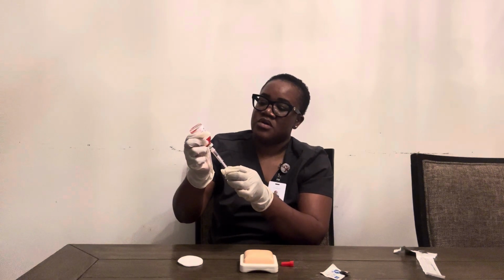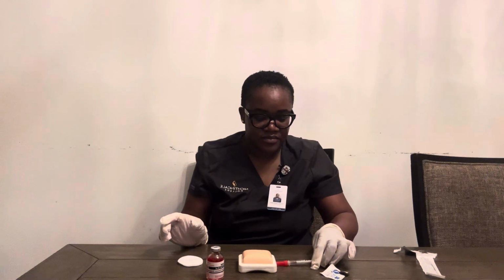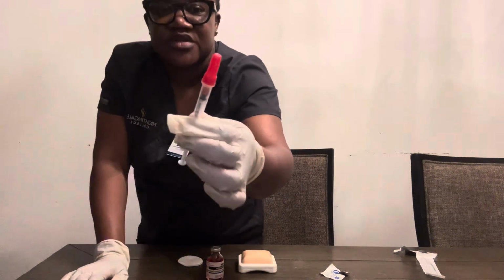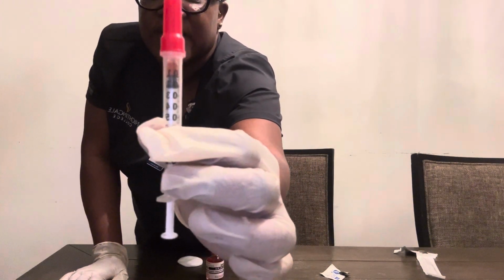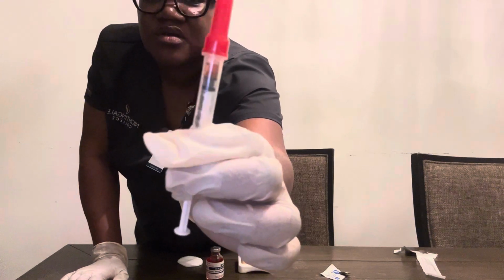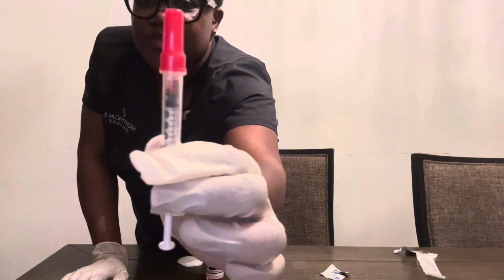Okay, so I'm going to recap my needle using the 1-hand scoop technique. And then let me just verify. I'm going to show it to the camera that I have my 0.1 milliliter of medication. And if this was prepared elsewhere, I'd have to label my syringe with my medication and my dose.